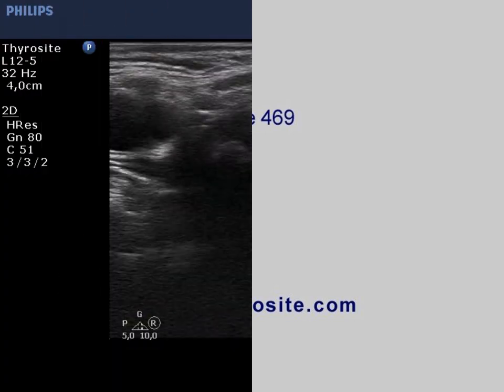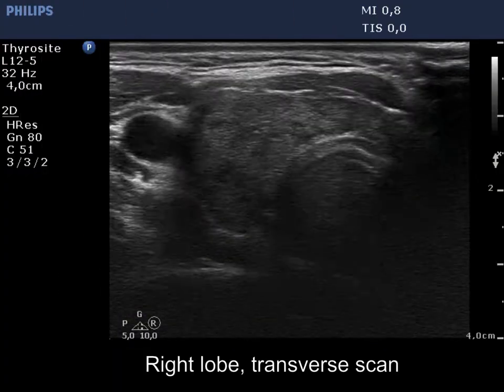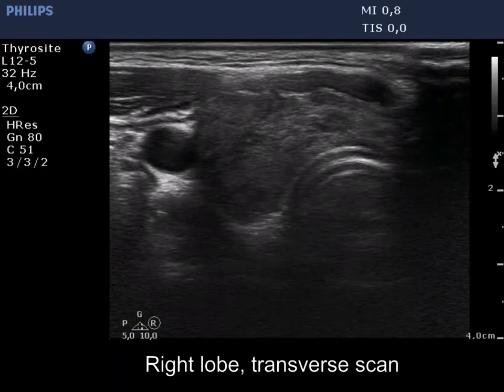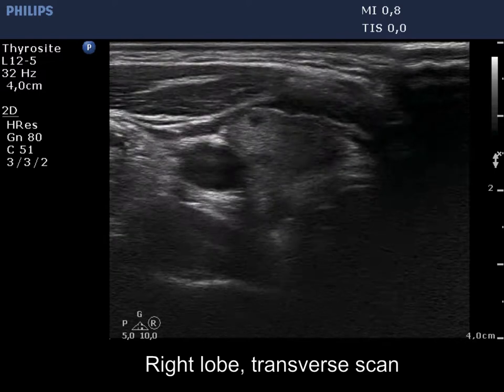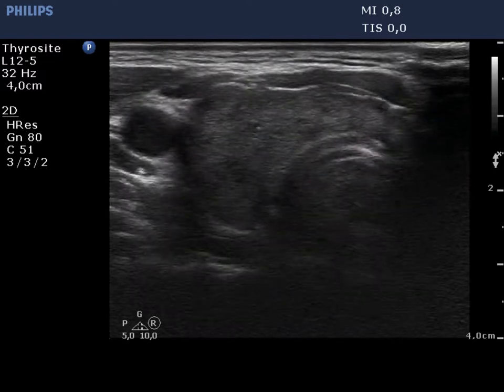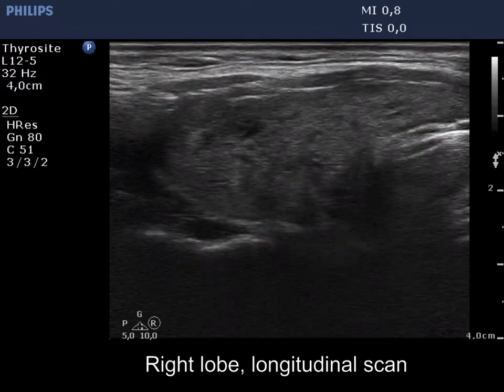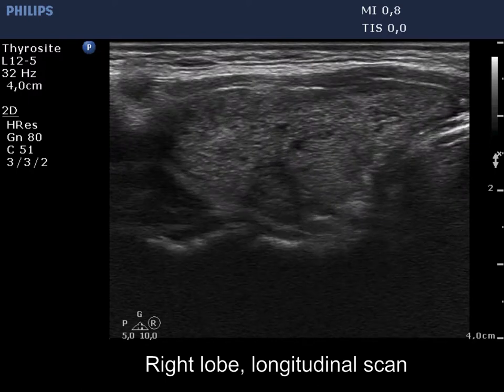The thyroid is minimally to moderately hypoechoic and contains smaller and larger discrete areas. This pattern corresponds to autoimmune thyroiditis.